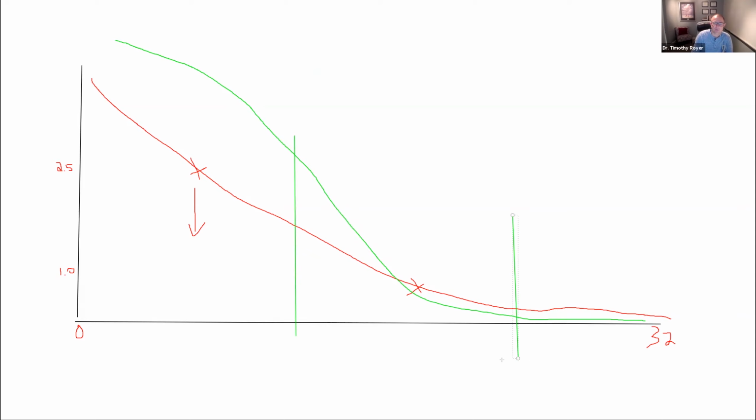Again, we've got our slow, parasympathetic brainwaves, our ideal brainwaves, and then our fast ones here, sympathetic. So what's happening here is instead of those frequencies landing at the right heights in their amplitudes, the thetas have huge spikes in them.